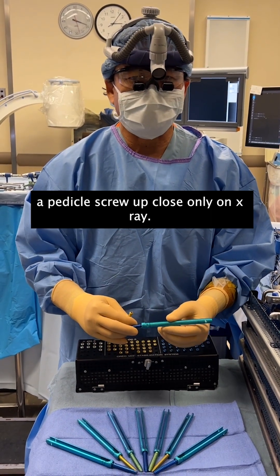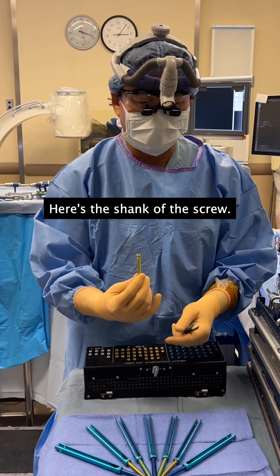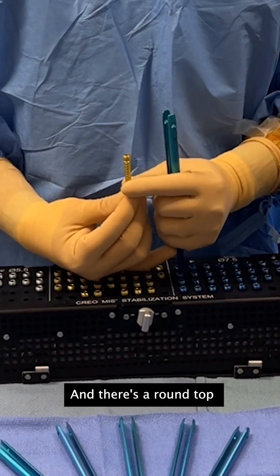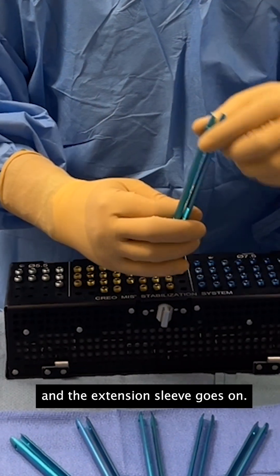I bet you've never seen a pedicle screw up close, only on x-ray. Here's what they look like. Here's the shank of the screw right here, and there's a round top where the head and the extension sleeve goes on.